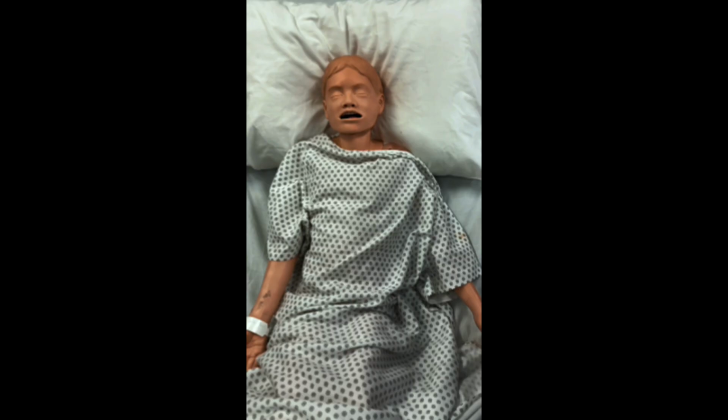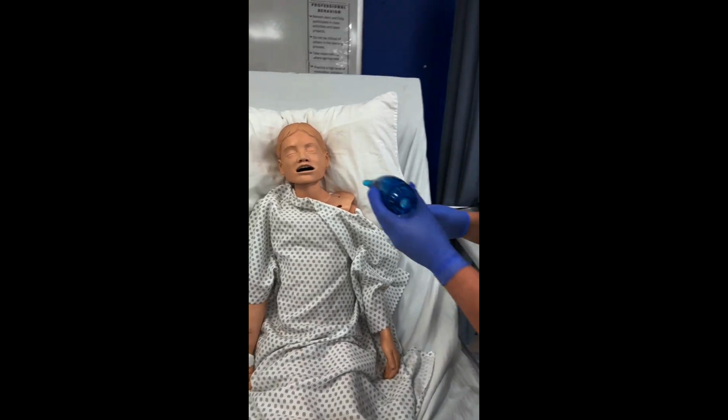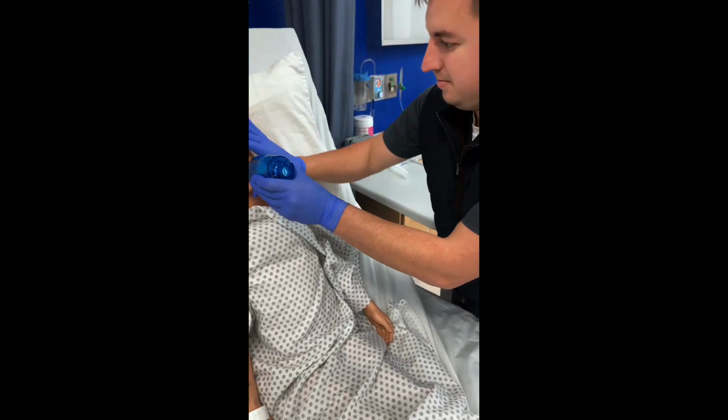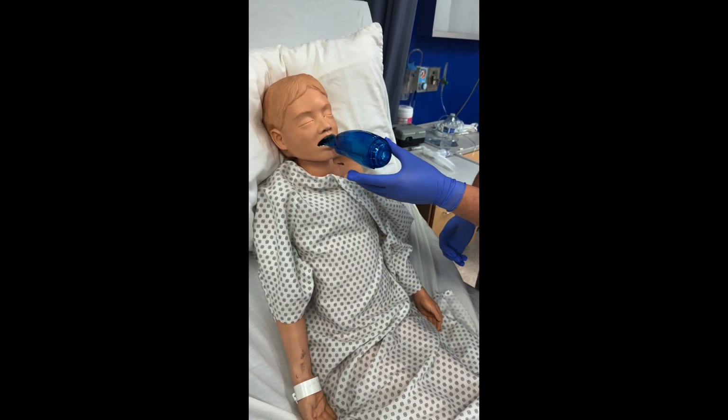I instruct the patient to place the mouthpiece in their mouth and form a tight seal around their lips. The patient then inhales slightly deeper than a normal breath and exhales slowly through the device. I adjust the resistance dial as needed so the patient can maintain a slow, controlled exhalation lasting approximately 3 to 4 seconds while feeling vibration in the chest. This confirms that the Acapella is set correctly and ready for airway clearance therapy.